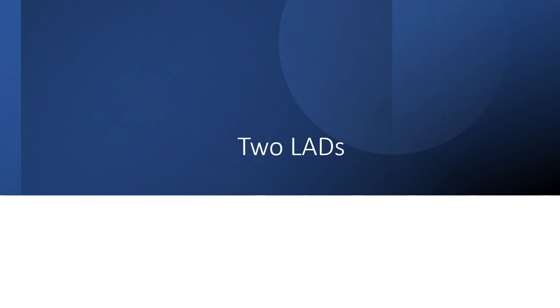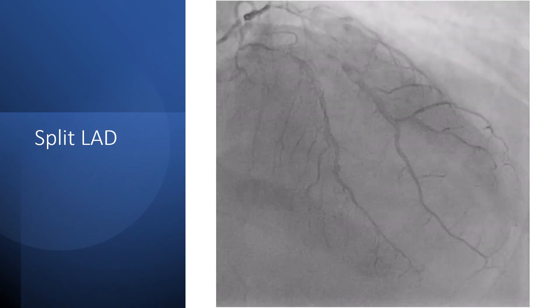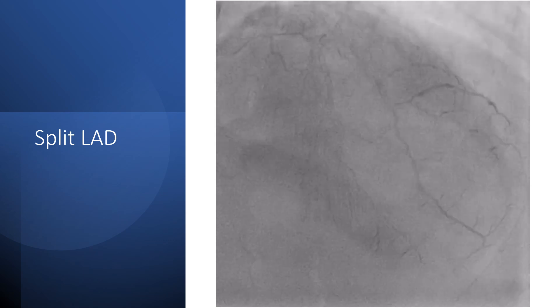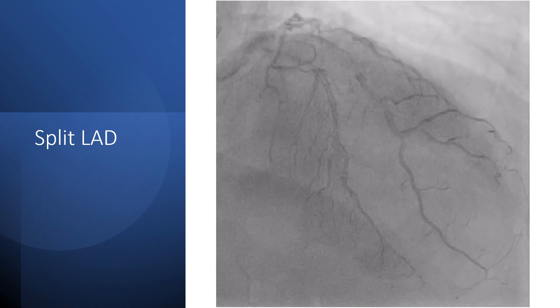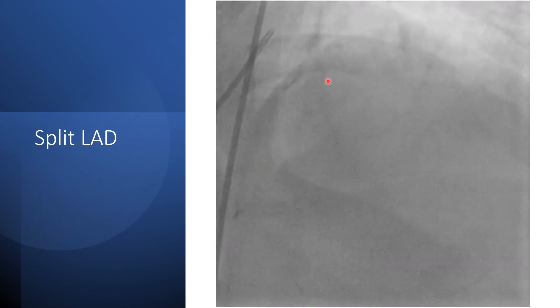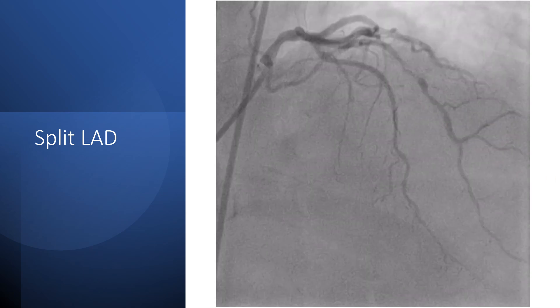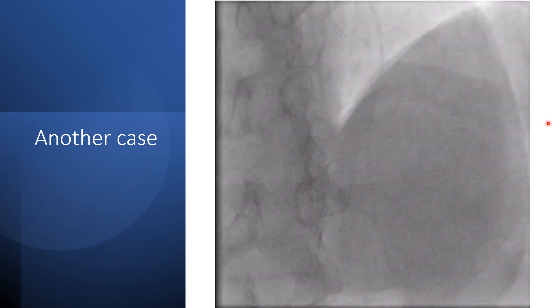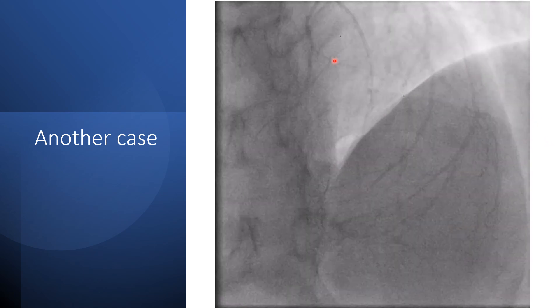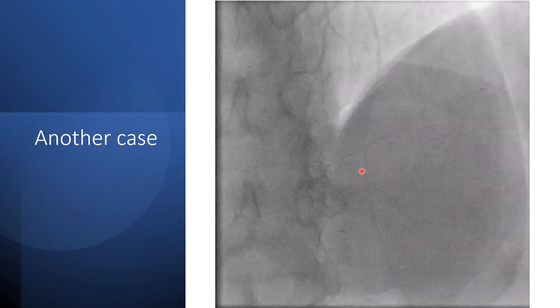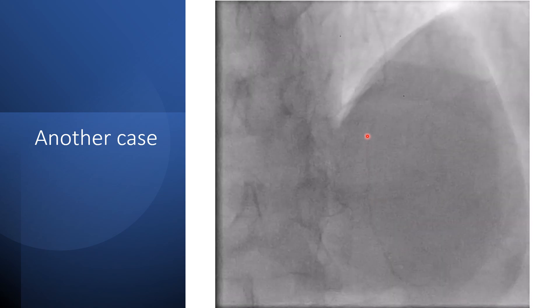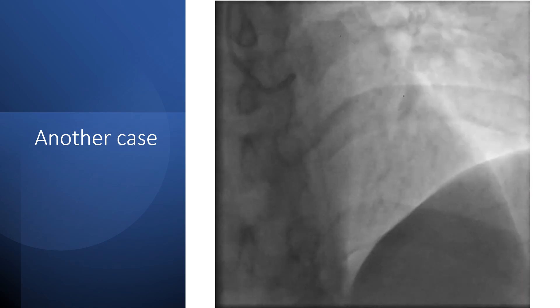Now we come to a condition where there are two LADs. There are different classifications, some of them are fancy, but we'll present what is simple and practical. First, we have what is called split LAD, which is actually a normal variant: two LADs running along the interventricular groove, one supplying the septal branches and the other supplying the diagonal branches. In this other case of split LAD, the other LAD is subtotally occluded and faintly visible running alongside the first one.